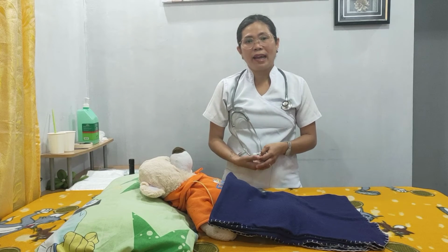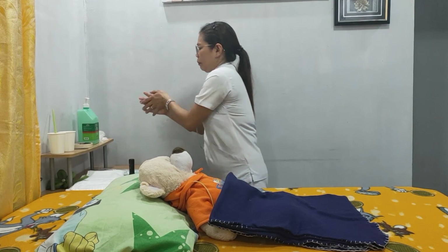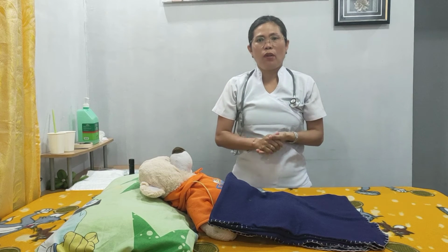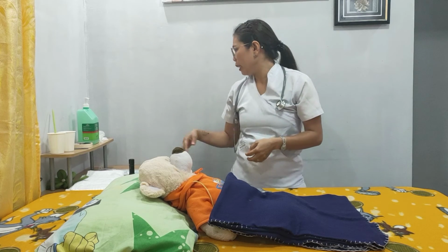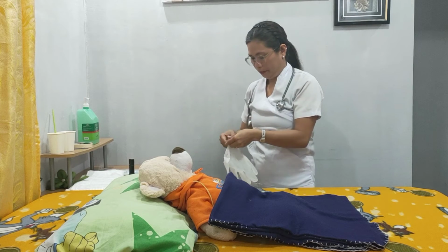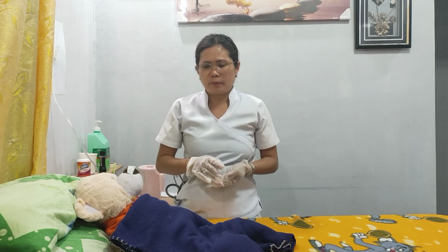Next is to perform hand hygiene. Then, wear disposable gloves because hand hygiene deters the spread of microorganisms. Position your client with the head of the bed elevated at least 30 to 45 degrees, because this position helps avoid aspiration of the feeding solution into the lungs.